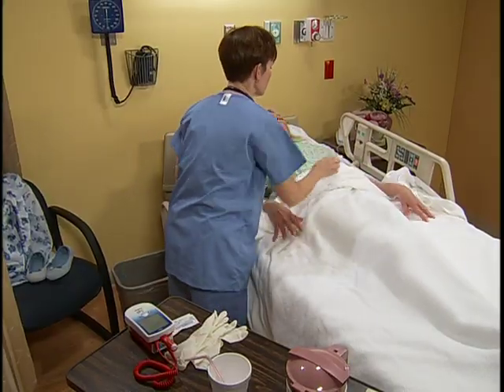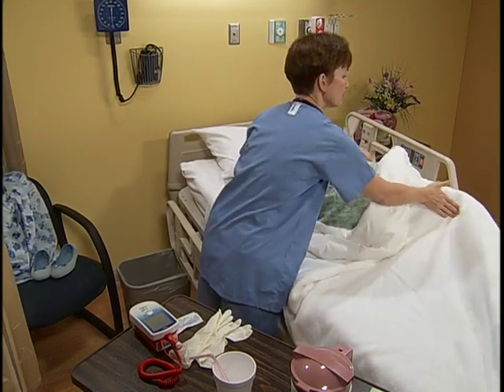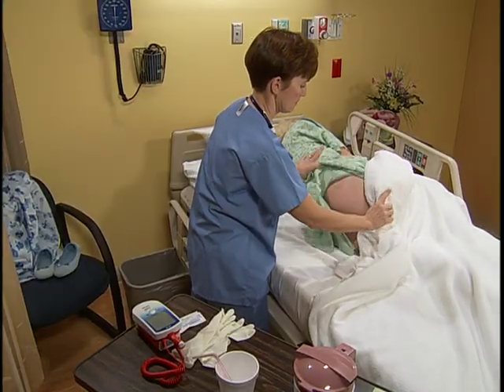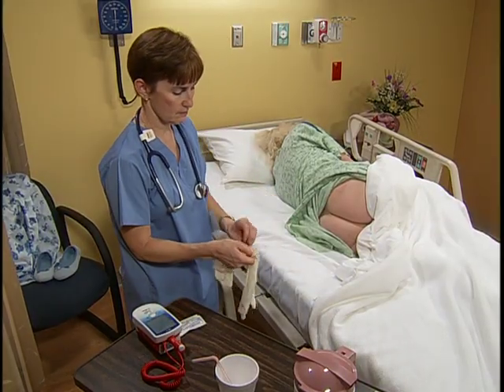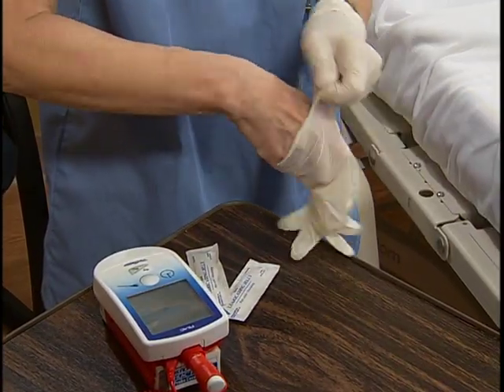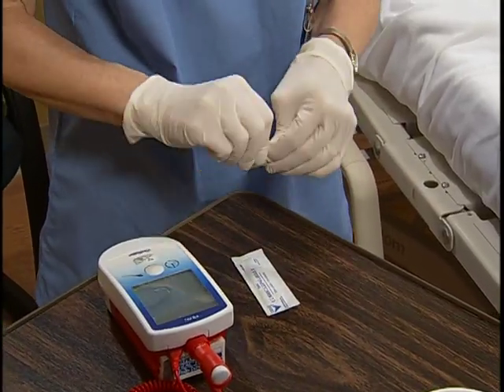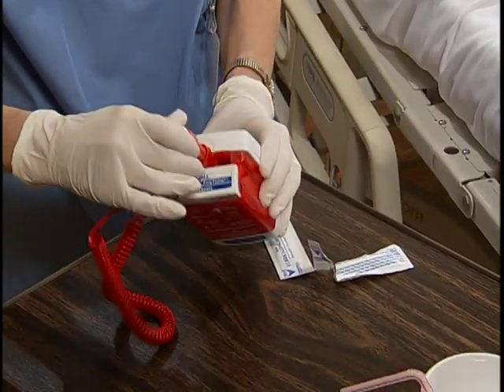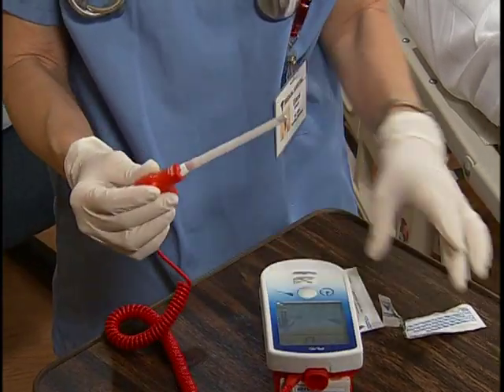We're going to need for you to roll on your side — this knee forward. That's good. Move the bed linen to expose her anal area while keeping her upper body and legs covered. After putting on gloves, open the lubricant packet and then remove the thermometer from the charging unit. Using the red tip rectal probe, slide a disposable cover over the probe.